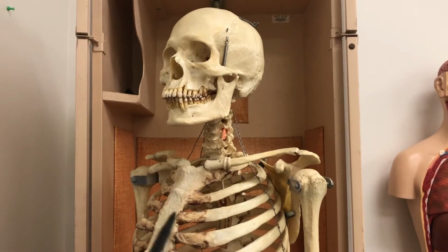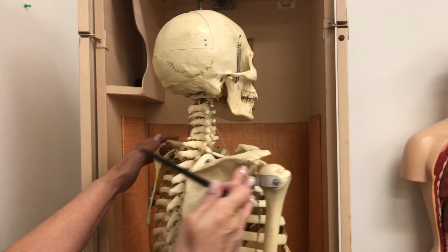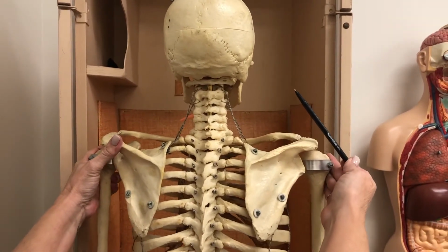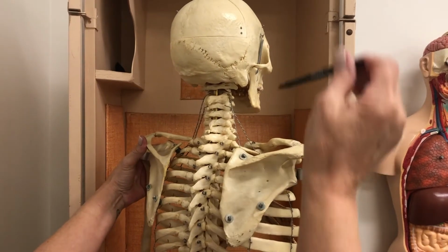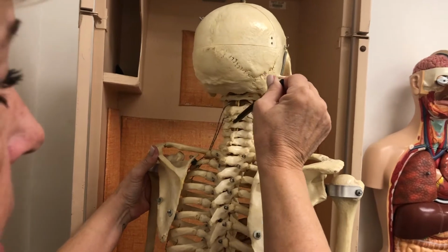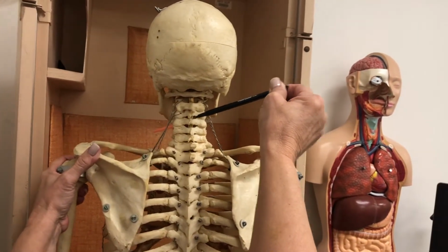If I was doing PA obliques, okay, I would have to rotate the patient 45 degrees, and now I'm going to angle 15 caudad, and now you can imagine that the pen is exiting through that straw.